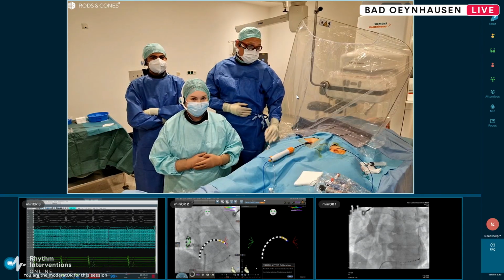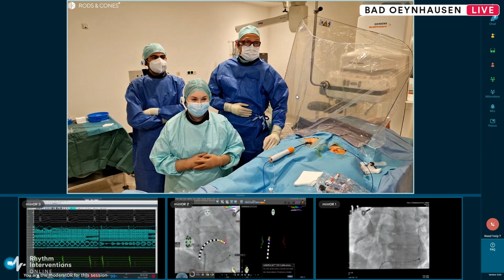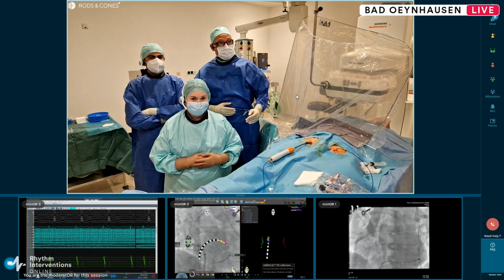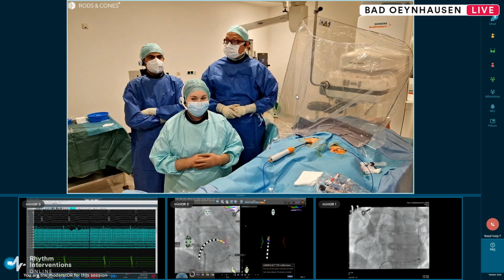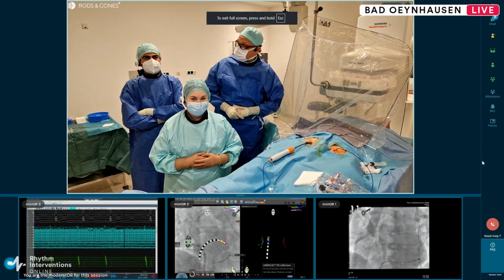And of course, we would like to say thank you to the patient who gave us the consent to do this live case here with the Varipulse device today. Before we start the case, Dr. Tchaikovska will give us a short introduction about the patient and his individual AFib history. Frau Tchaikovska, please take over.